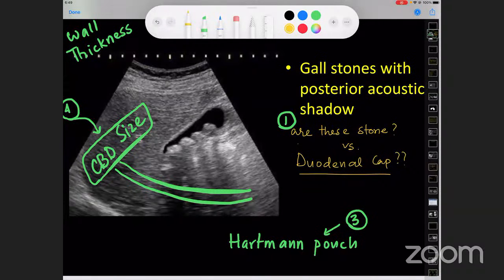Avik, just a second. You see, there is a question now. Both of us are surgeons, and we have had our fair experiences of the duodenum or the colon being stuck on to the gallbladder. Can an ultrasound predict this? As surgeons, we always have a curiosity whether the duodenum or the colon is very near, so that our operative plan may change. You may need to call in a senior colleague with you. Can we understand or predict this with an ultrasound?